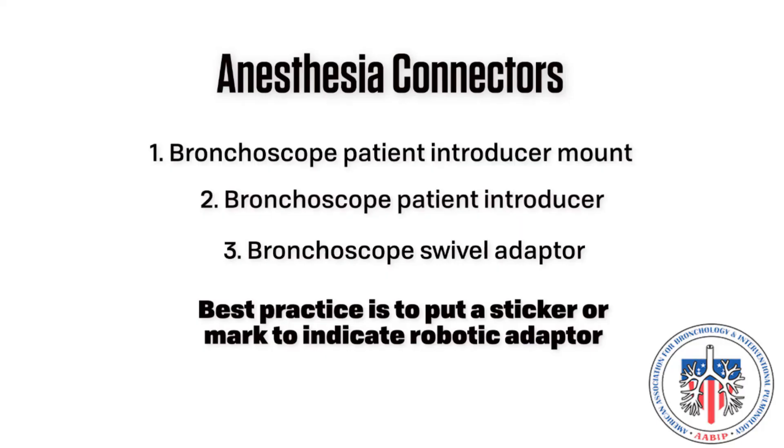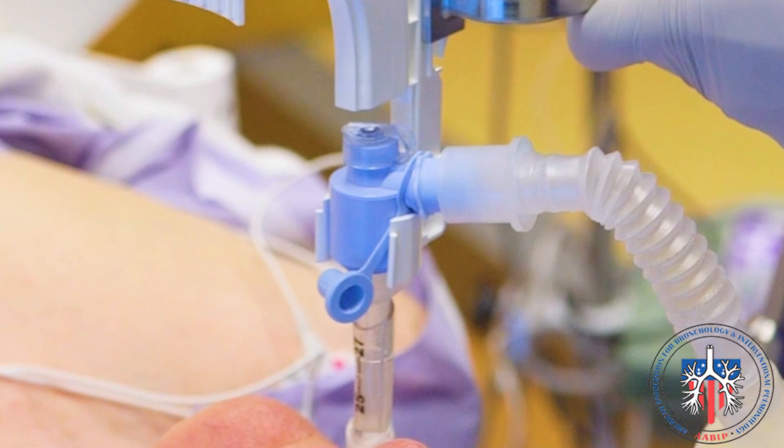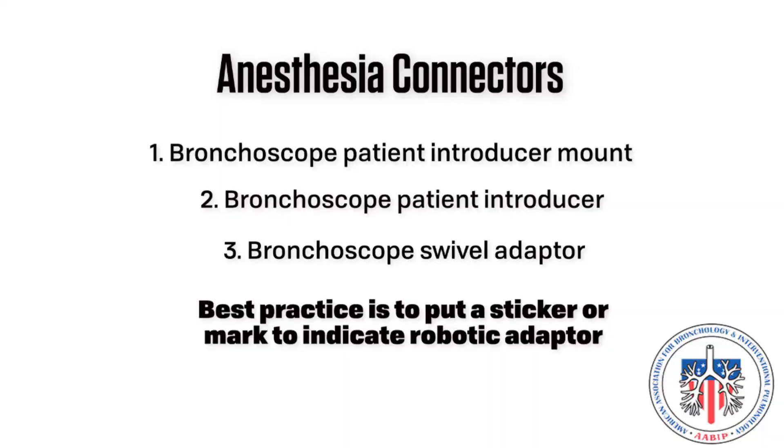Number three: the bronchoscope swivel adapter. The associated kit includes a medium-sized silicon scope adapter. This is the correct fit for the Monarch robotic bronchoscope and sheath and will reduce air leak from the endotracheal tube that might occur if a larger adapter is used. Best practice is to label the Monarch swivel adapter with a sticker or marking to distinguish it from the regular bronchoscope swivel adapter to avoid confusion.